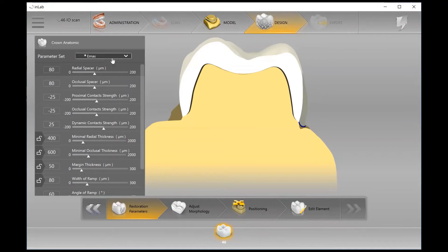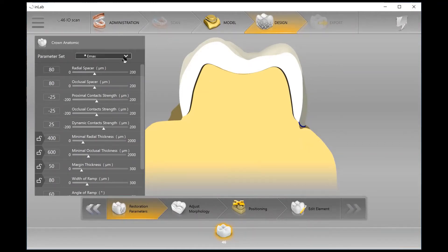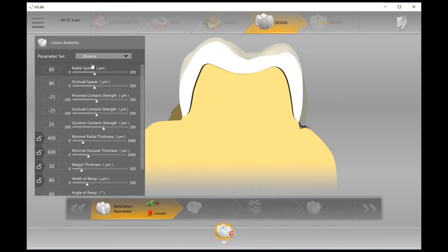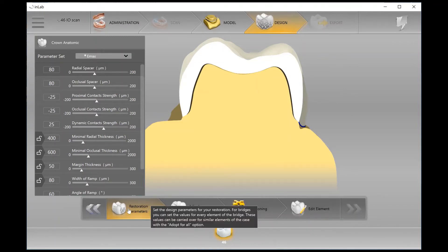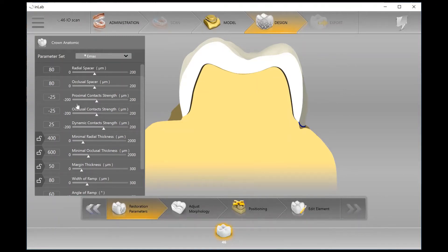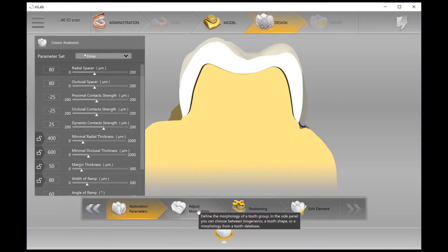The very first step of the design phase is always the parameters. You're able to set parameters based on what material you're using, based on doctor preference, or anything else you might need — a really nice way to quickly change any parameters as needed.